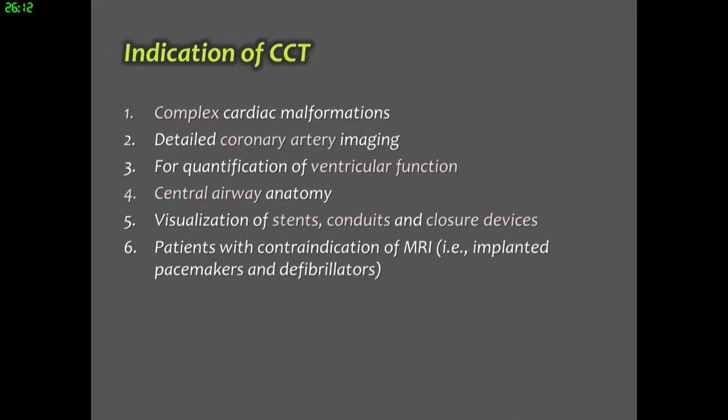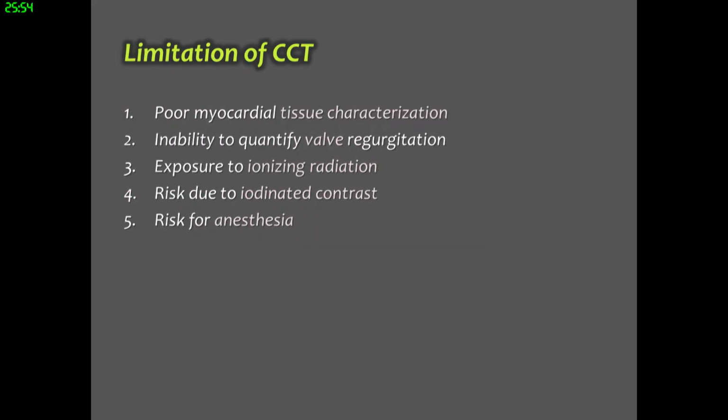The indications of CCT are as follows: complex cardiac malformations, detailed coronary artery imaging for quantification of ventricular function, central airway anatomy, visualization of stents, conduits, and closure devices, and patients with contraindication of MRI. Limitations of CCT include poor myocardial tissue characterization, inability to quantify valve regurgitation, exposure to ionizing radiation, risk due to iodinated contrast, and risk for anesthesia.